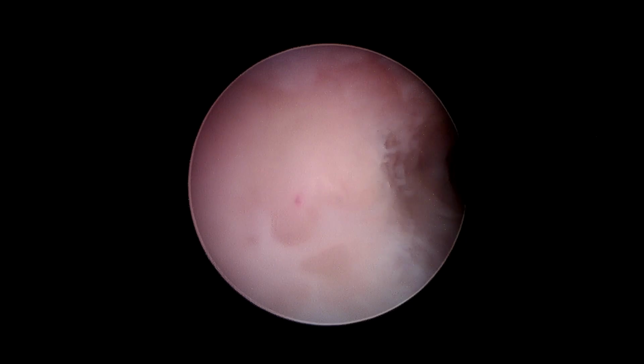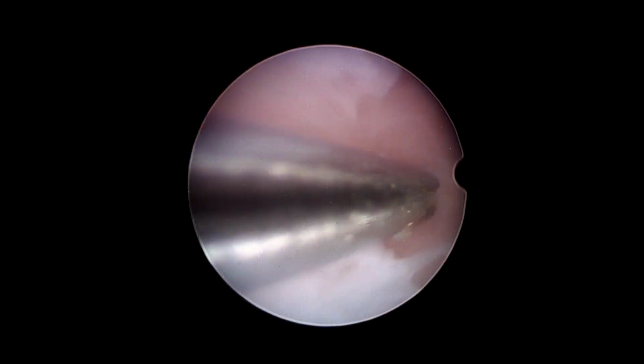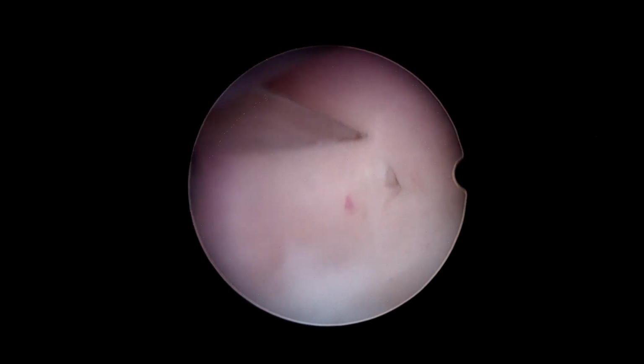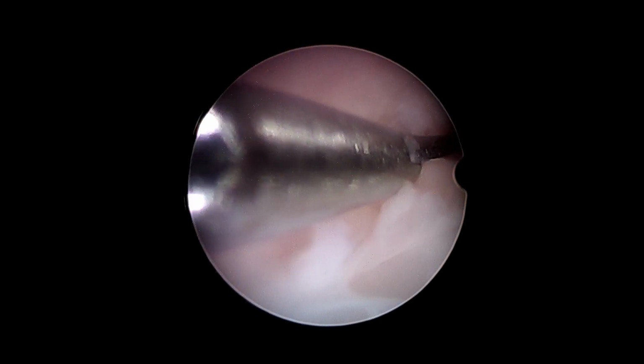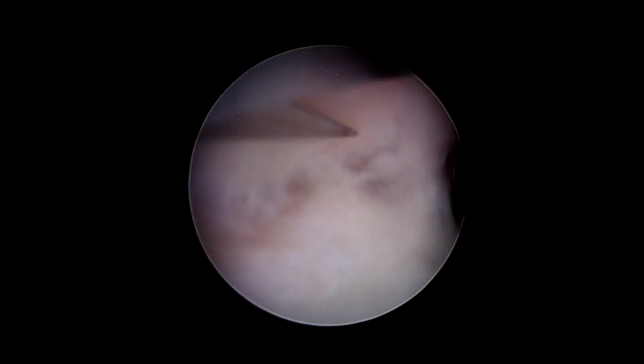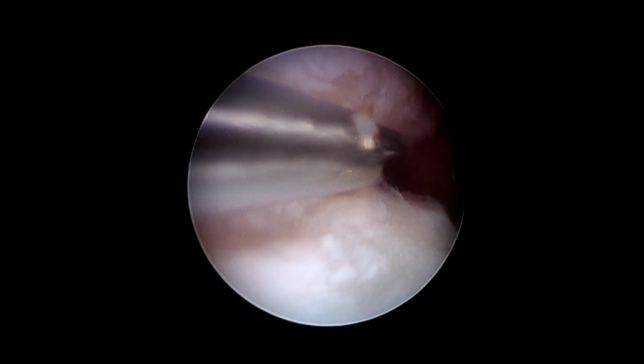These are the adhesions on the left and right lateral wall of the uterus. Here again we are doing the probe test. We are pushing the scissors inside and then going exactly in between the adhesion, equidistant from both the anterior and posterior wall of the uterus. Once you do that, you avoid going into the muscles of the uterus.